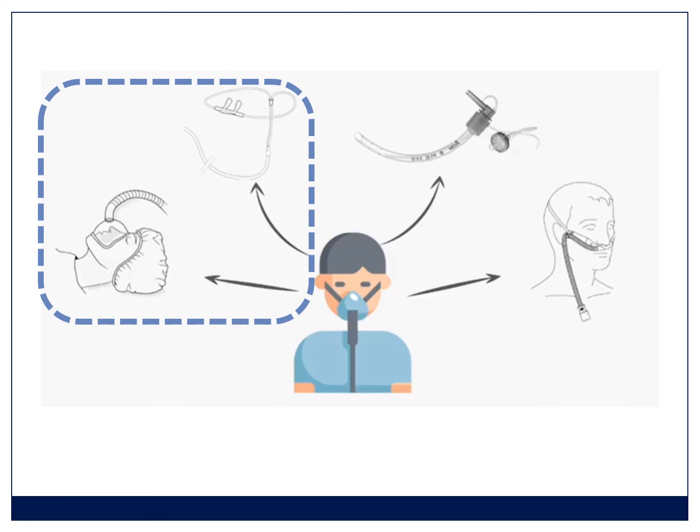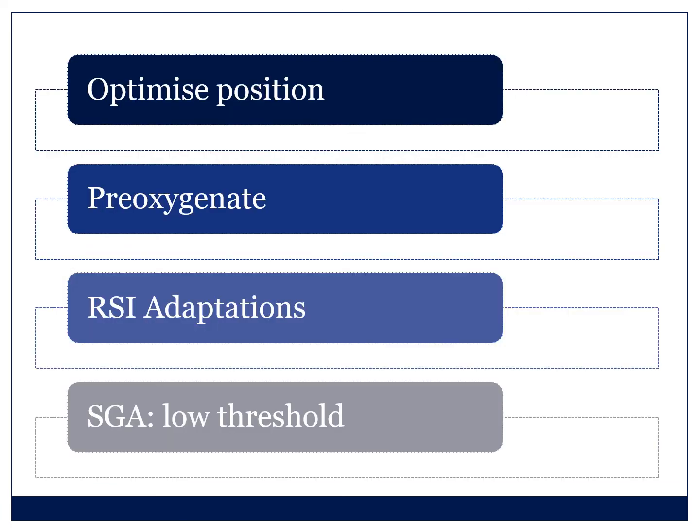It means that while you're busy with laryngoscopy and trying to put the tube in, there's a continual oxygen supply to the back of that airway, which will potentially delay time to desaturation, which is what you want, especially if you're struggling. Those two measures are possible at any district hospital. You should have the equipment to do both of those. Once you've pre-oxygenated adequately, you then move on.